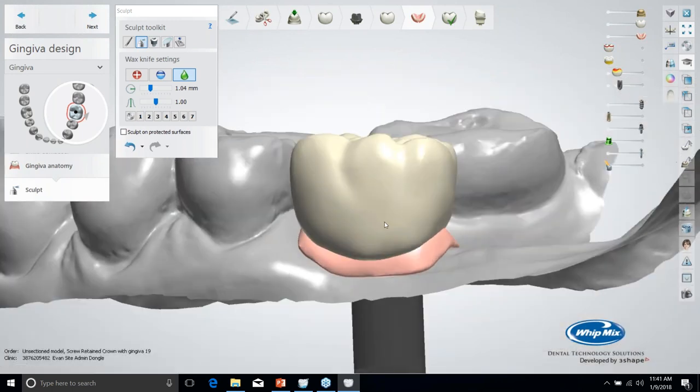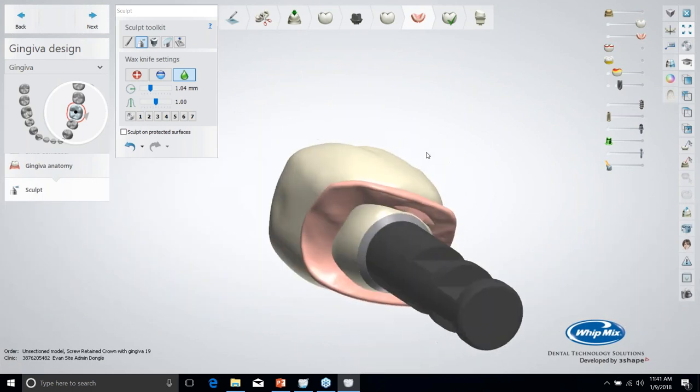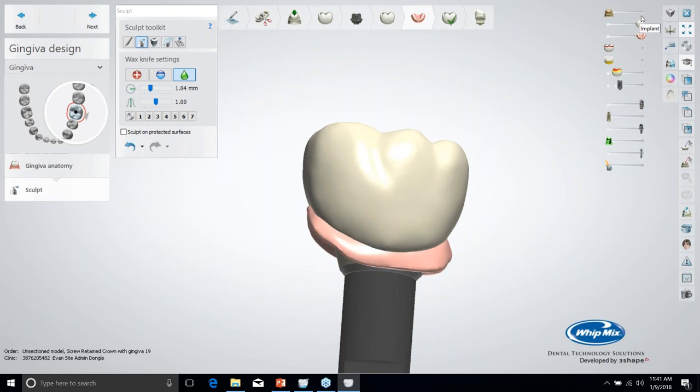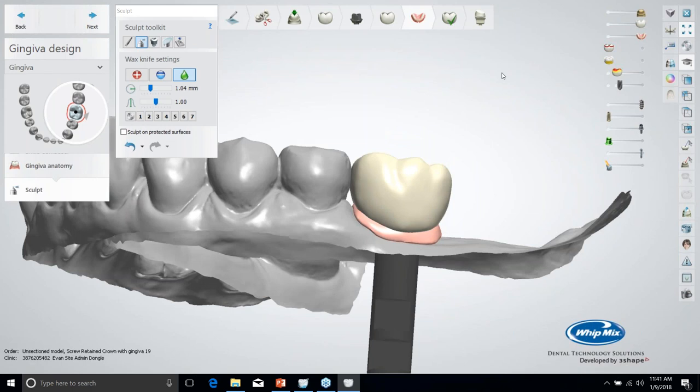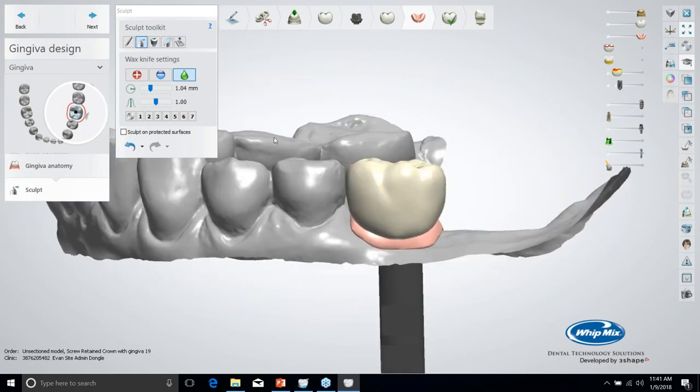So now if we're happy with our tissue, and you can see if I hide the scan, it's actually cut that tissue right in line with the tissue that's on the model. Now, like how I sculpted it before, if you have a stone model and you know you want to make some changes to the tissue, then you need to make the changes to the stone model before you scan it. But if it's an impression scan or intraoral impression scan, you can sculpt the raw scan.